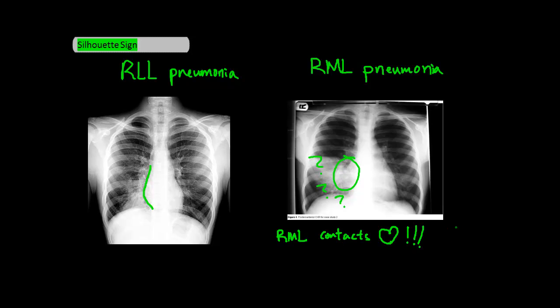In the film with the right lower lobe pneumonia, the right middle lobe is not affected and still consists of air inside. And because the density of the air is different from the density of the right heart which it borders, we can still see this border clearly, even though there's a right lower lobe pneumonia present.